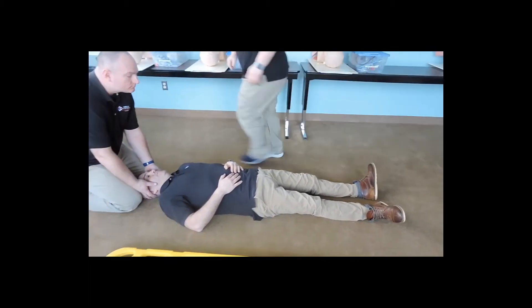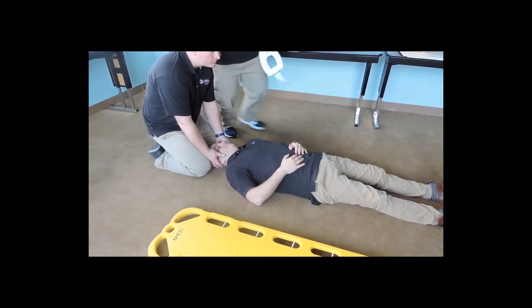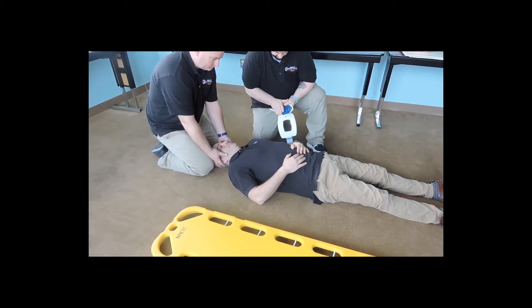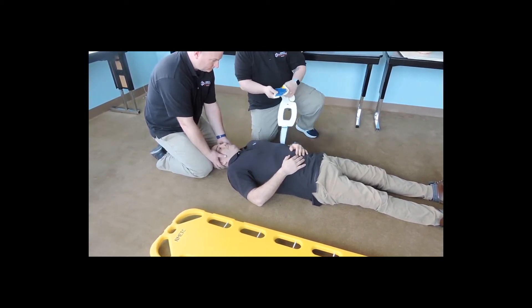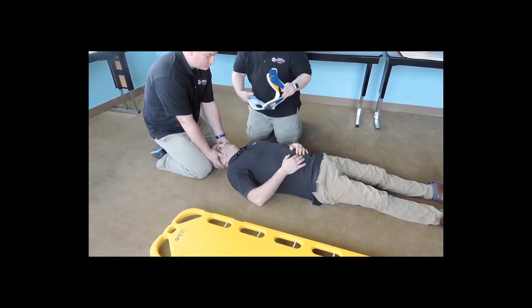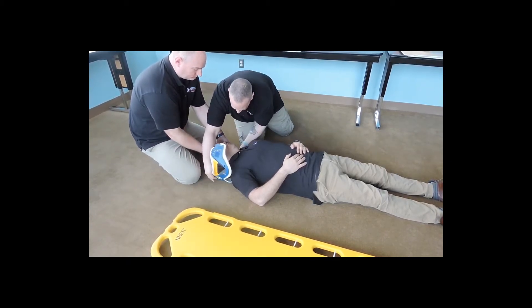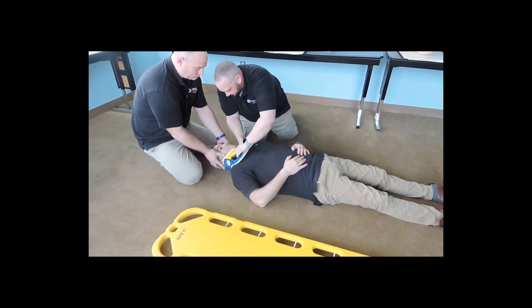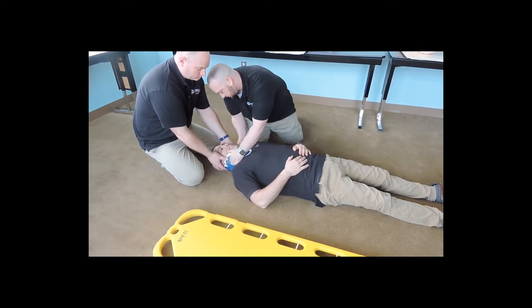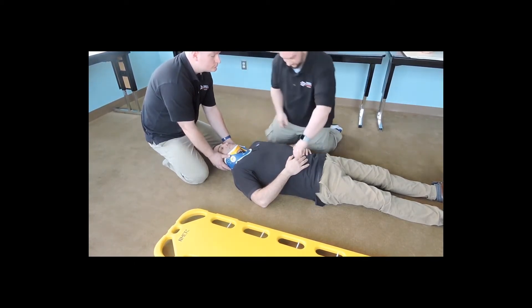At this time I'm going to get my collar. With my partner holding C-spine, I'm going to measure from the trapezius to the angle of the jaw, then measure against where it sits on the collar. Make sure that it's sized appropriately and that it is locked into place. Working around my partner, I'm going to slide this through. This will be applied on bare skin. I'm going to scoop this into place, make sure that it's secure. We're still able to see through the window for JVD or tracheal deviation.